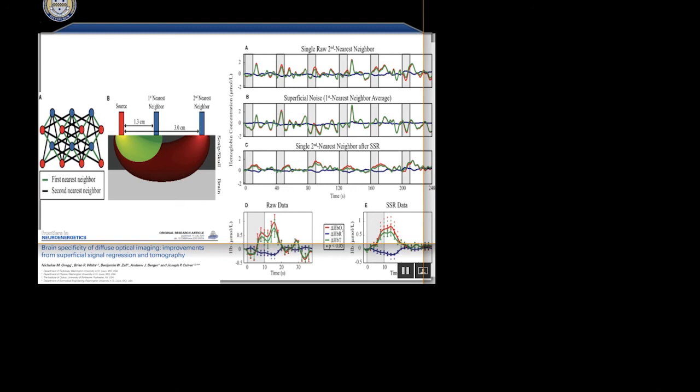While from a physics point of view maybe that is the best solution, from a practical point of view, I'm not willing to sacrifice 2/3 of my detectors to do that measurement. Because now I'm going from an 8-channel NIRX system to a 24-channel NIRX system just to do that. Unfortunately, we don't have a great answer for it yet. I mean, you're probably asking, what kind of system should I buy, how many detectors am I going to need, and do I have to worry about this?